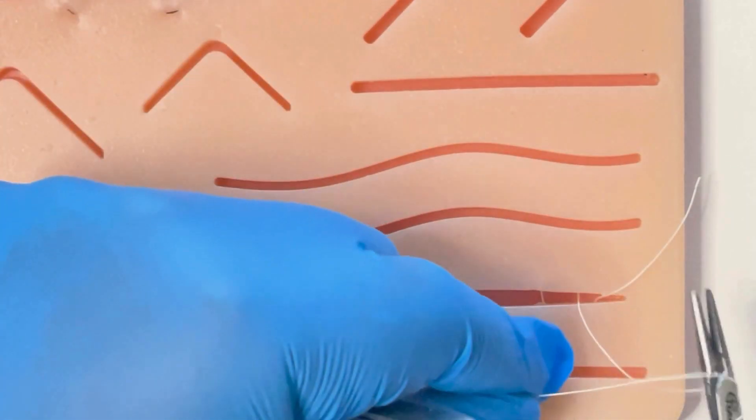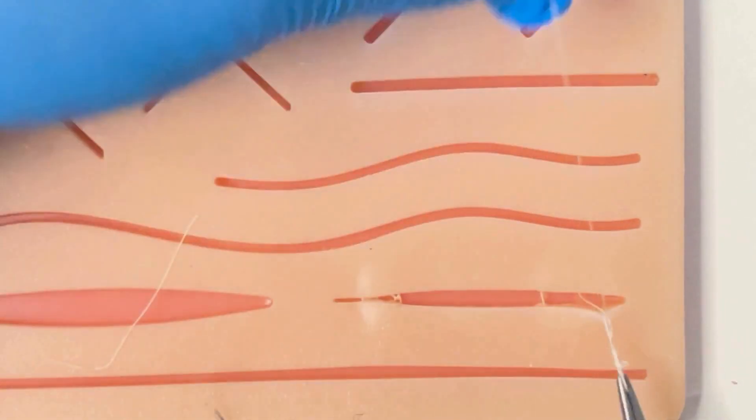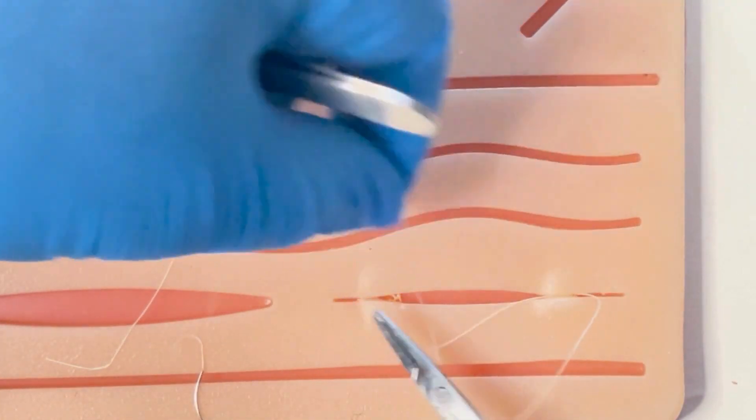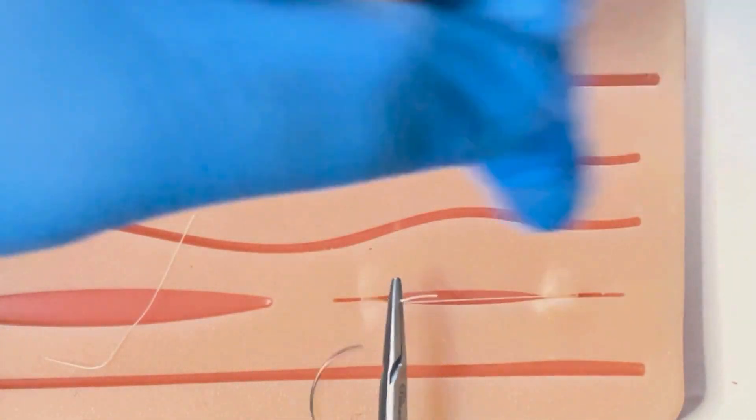You tie your knots parallel to the wound. This is a useful stitch for eliminating tension from a wound. You typically use a long lasting dissolvable suture.